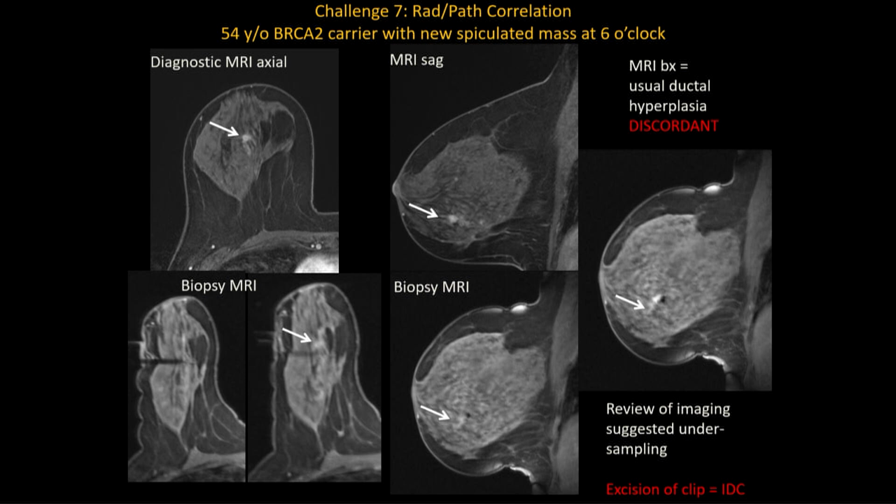You can see that on day of MRI biopsy, here's the obturator and there is the mass, so it is a little bit distant from the finding. This is the area on the sagittal view, and this is your obturator, and you can see that it's a little bit distal from it, or distant from it. This is where post-biopsy imaging is very helpful. You can see this area of hematoma, but however, the finding was not appropriately biopsied.